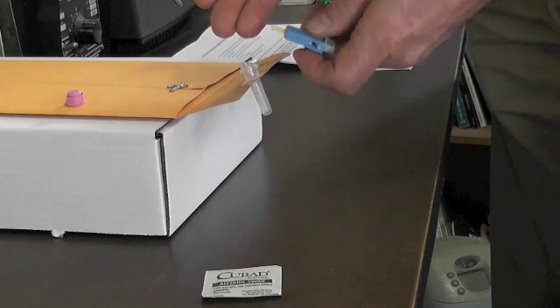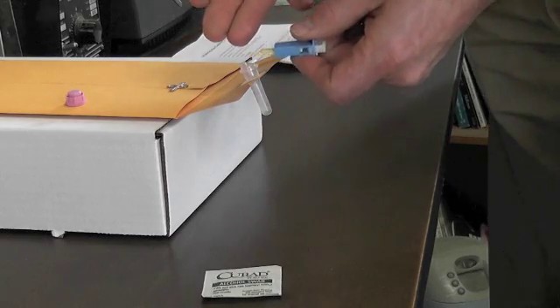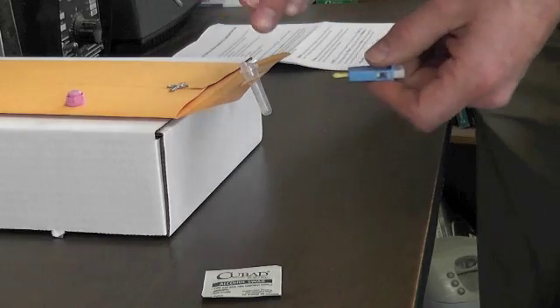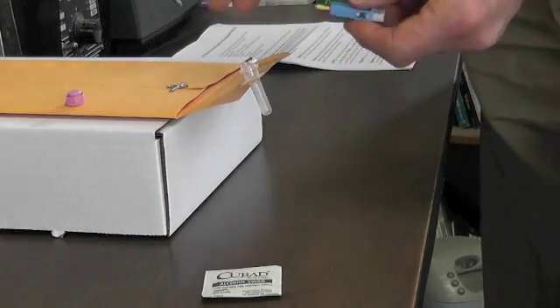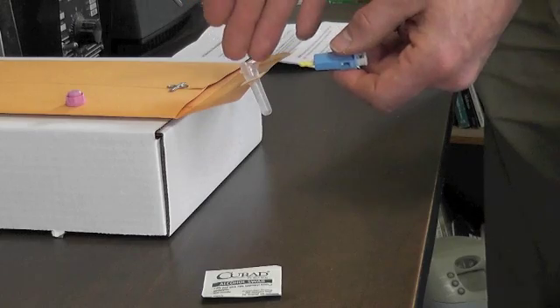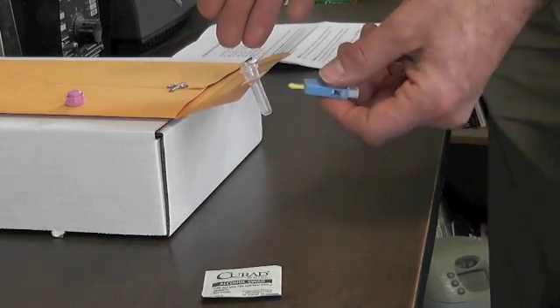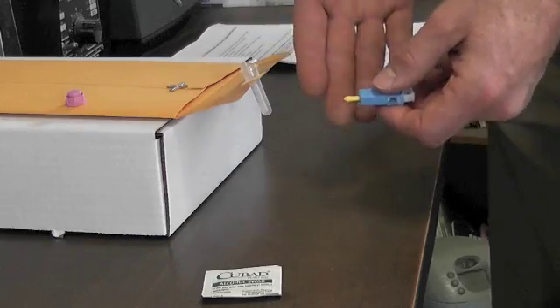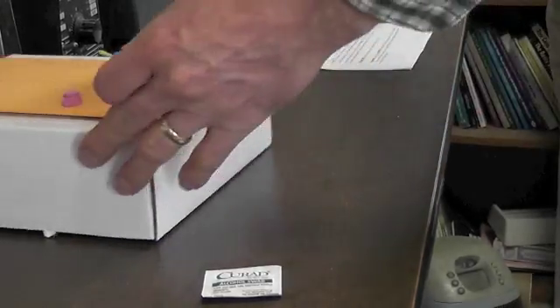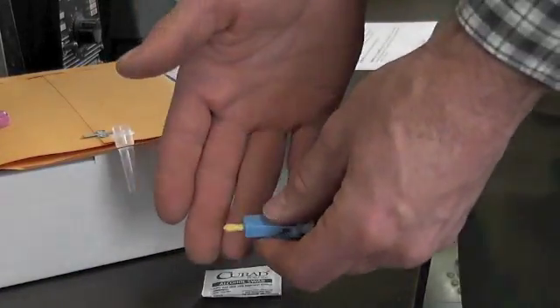What you're going to do is prick it there, then that's going to drip down into the tube. So you want the side that's easier down so you don't have to turn your arm around upside down and stand on your head. It's really hard that way. We're trying to make this easy for you here.